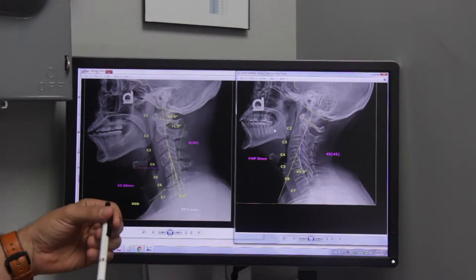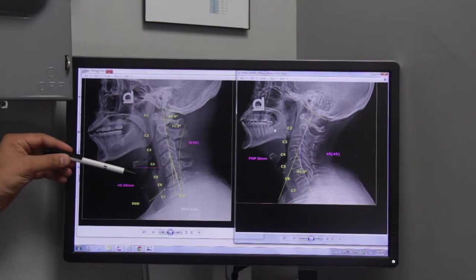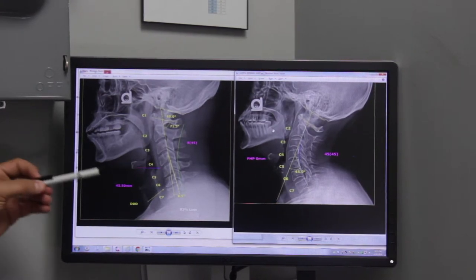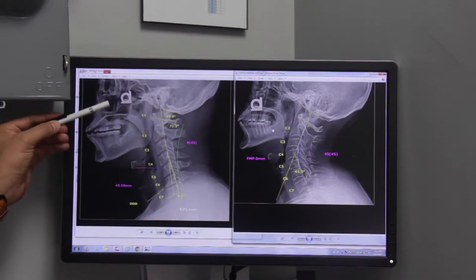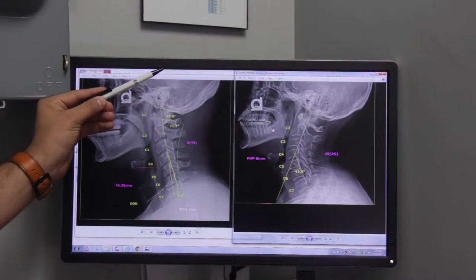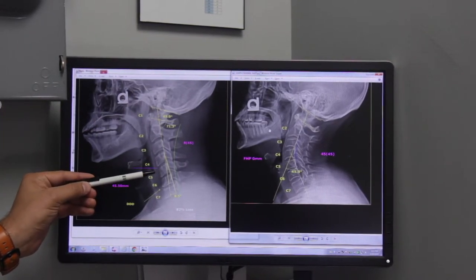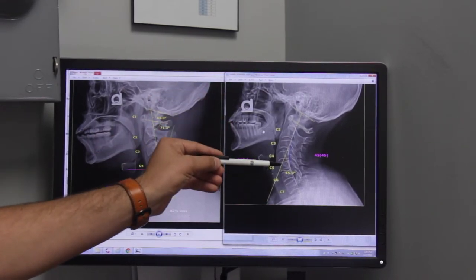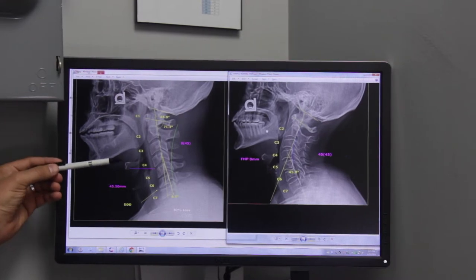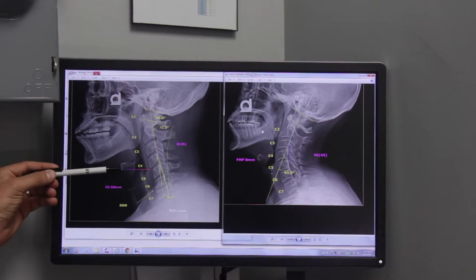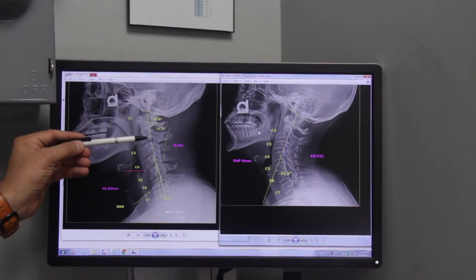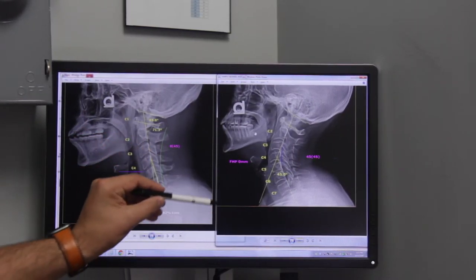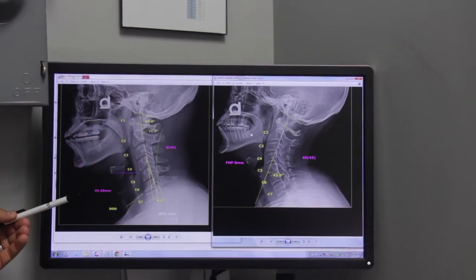The second feature that we look at is forward head posture. Forward head posture measures how far the person's head has moved the wrong direction, which would be forward. We want the position of the head right over top of the C4-C5 joint. You'll notice in our sample it's at zero position, right over top. This gentleman has a 45 millimeter forward head posture. This is important because it puts a lot of strain on the back of the neck, where many times people have tight shoulder and neck muscles because of that position.